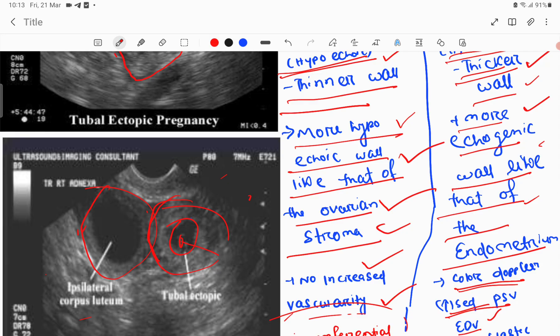If you see the wall is hypoechoic and similar to the ovarian stroma, compare it with the ovarian stroma. If the ovarian stroma echogenicity is similar to the wall of the lesion, then it is a corpus luteum. If the wall is more echogenic — hyperechoic, appearing more white, similar to endometrial thickness — then it is an ectopic pregnancy.